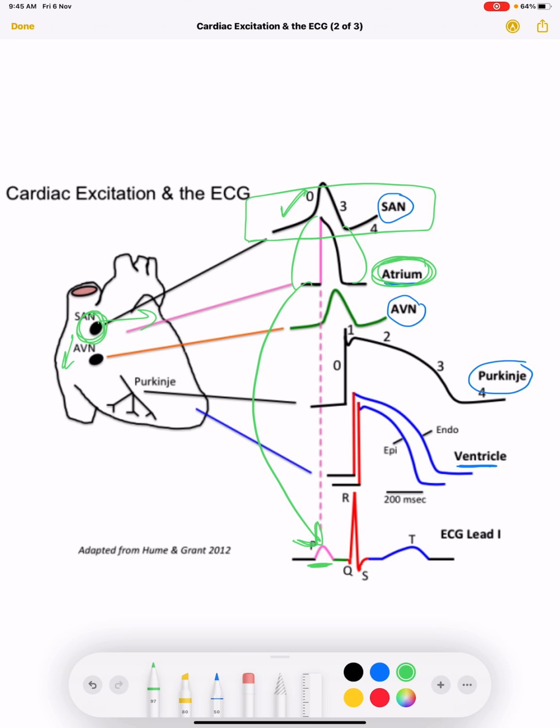So when you look at the P wave, you should think about atria, you should think about atrial depolarization, and any change in the atrium will lead to a change in the P wave. Any enlargement in the atrium, any irregularity, any extra focus of origin of some impulse in the atrium will lead to a change in our P wave. So P wave represents atrial depolarization.